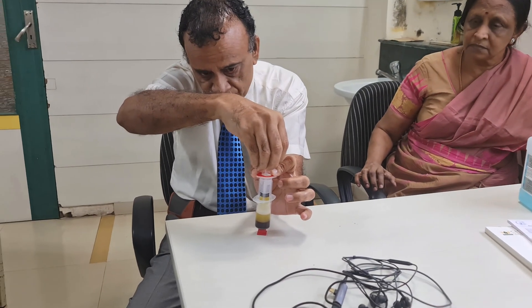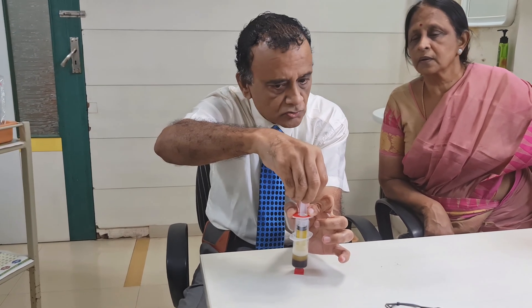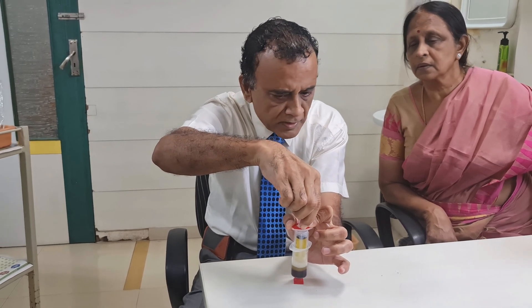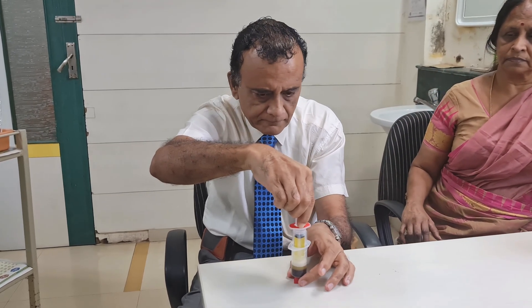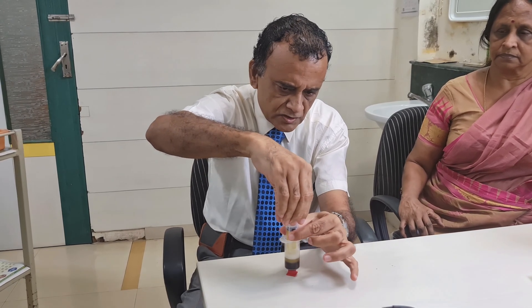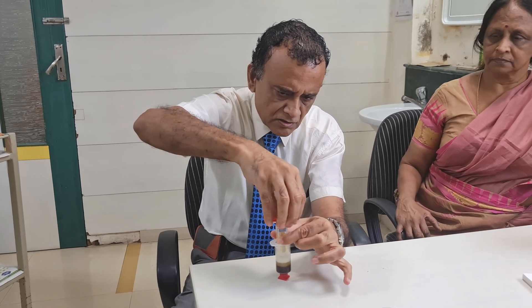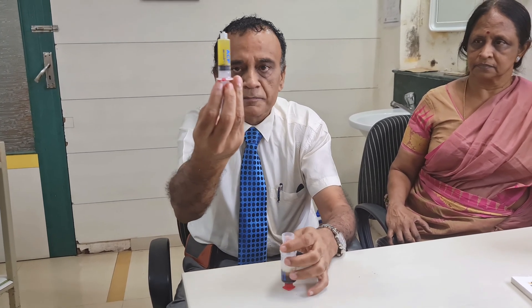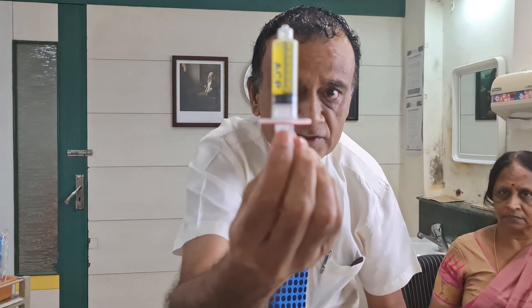You can see that the PRP is rising from the outer syringe into the inner syringe. Now we remove this inner syringe by turning it anti-clockwise. And this is the PRP. We have got 6 ml of PRP here and we are ready to inject this.